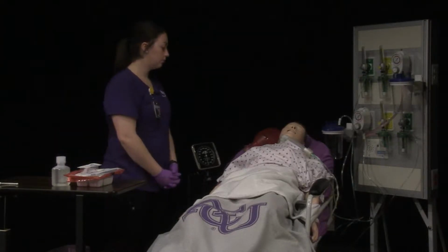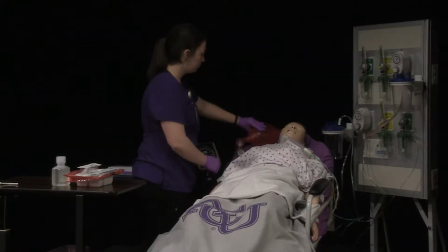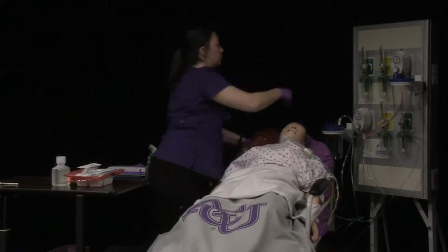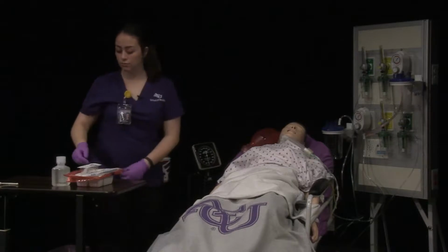Place ambu bag at head of bed and ensure it is operational and has 100% oxygen airflow. Place biohazard bag within reach.